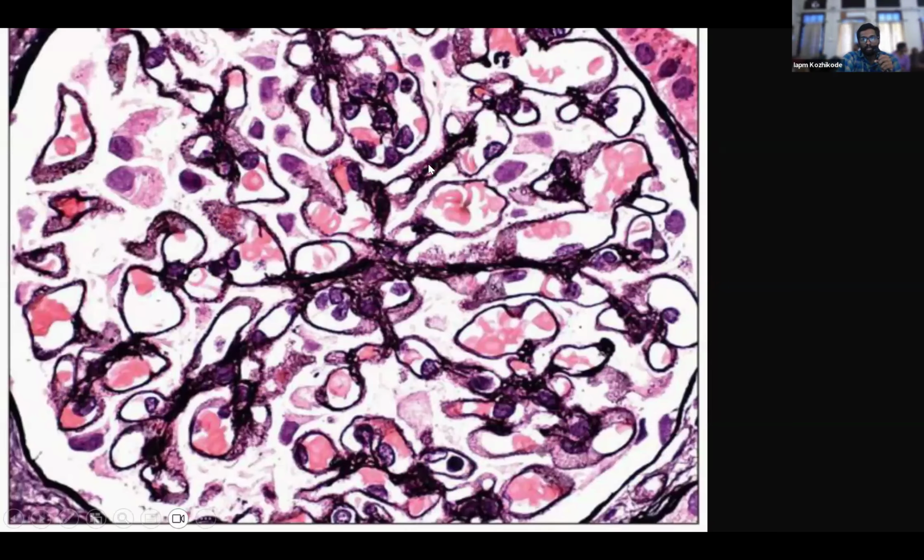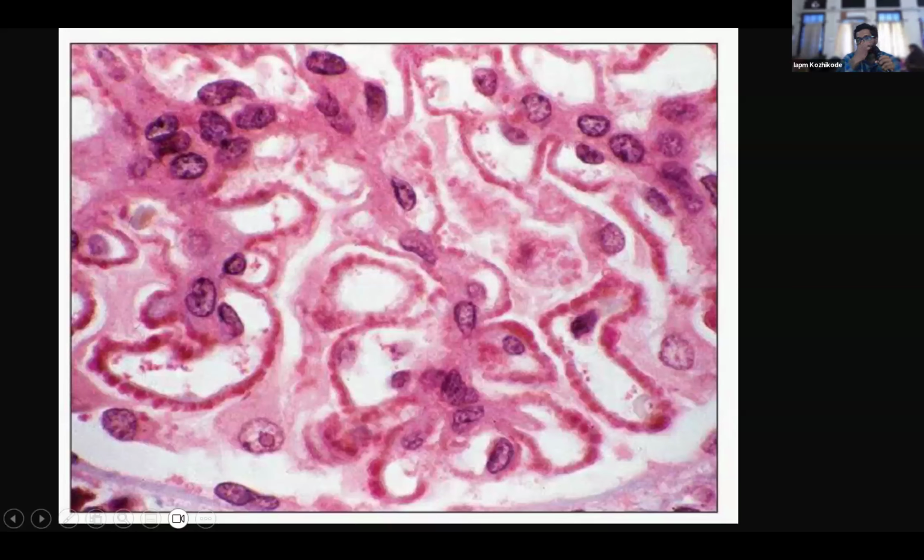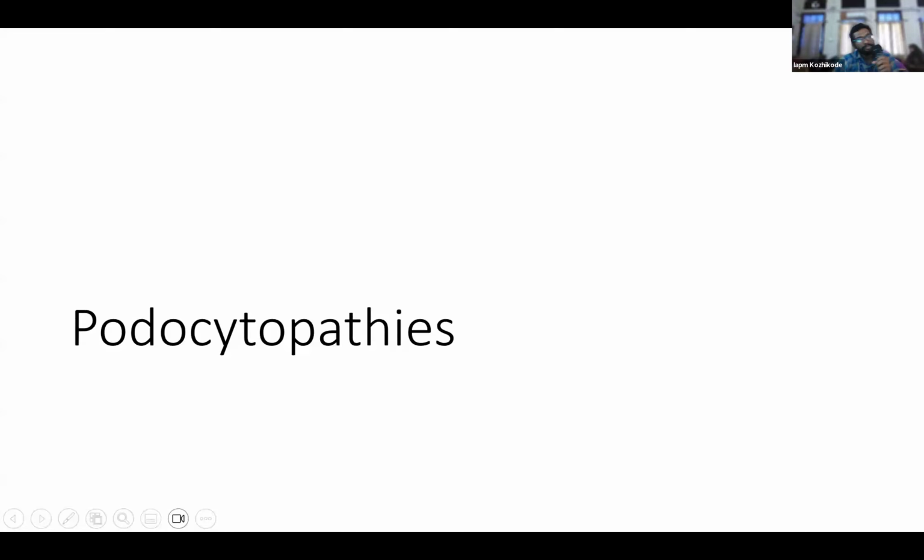But slowly, here and there, you can see small thickening has happened and small spikes have started to appear, and in the full-blown phase, you will have diffuse thickening, and you will have all the bubbles, vacuoles, thickening. Hair-like appearance, spikes, everything happens. Sometimes you may be able to identify the fuchsinophilic deposits of the antibodies in the trichrome stain. So that is about membranous nephropathy.